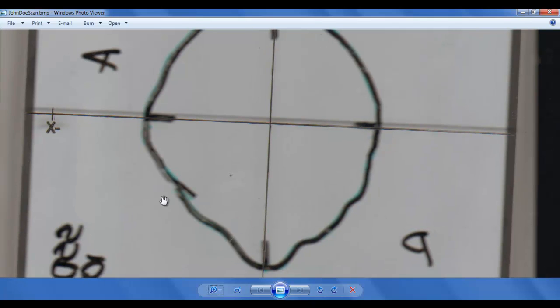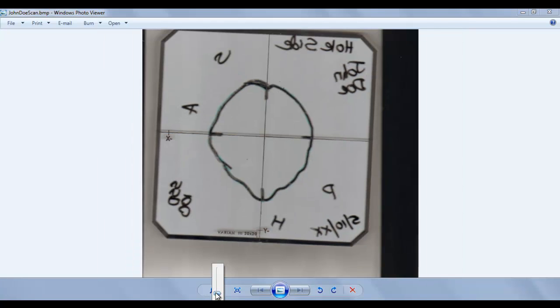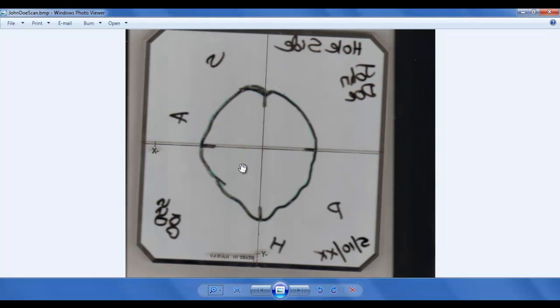Am I discretizing or digitizing to the inside of the line, to the outside of the line, to the middle of the line? If there's any artifacts, any smudges or smears or places where the lines kind of blur as to where we should go, make sure you communicate with whoever drew that as to what this part of the drawing really represents. Okay? This is no different than what you would do if you were manufacturing these blocks in your house by pouring Cerrobend, in your facility. So it shouldn't be anything that's too unfamiliar for those of you who have made these blocks in-house before.